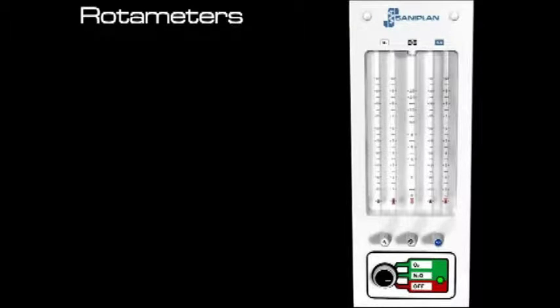Rotameters. A rotameter is an instrument consisting of a tapered vertical glass tube in which a small float, also called suspended body, is forced upward until its weight balances the flow force. The name rotameter derives from the fact that the float, while suspended, also rotates on its own axis.